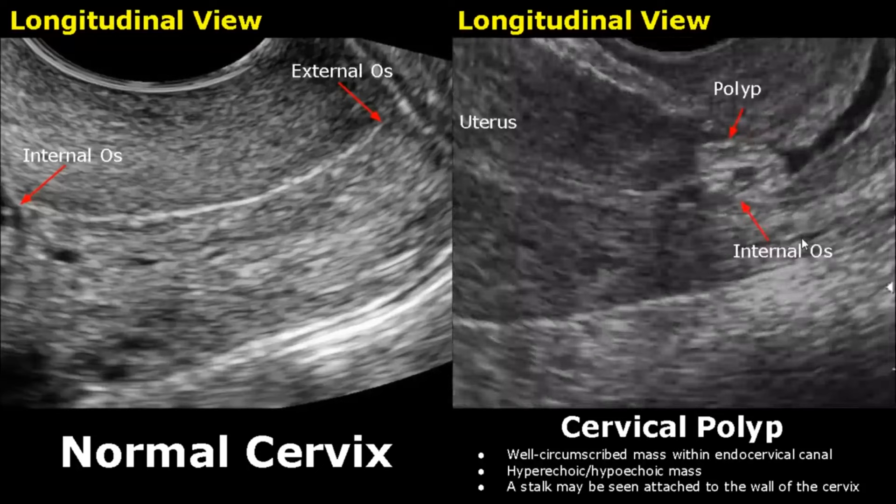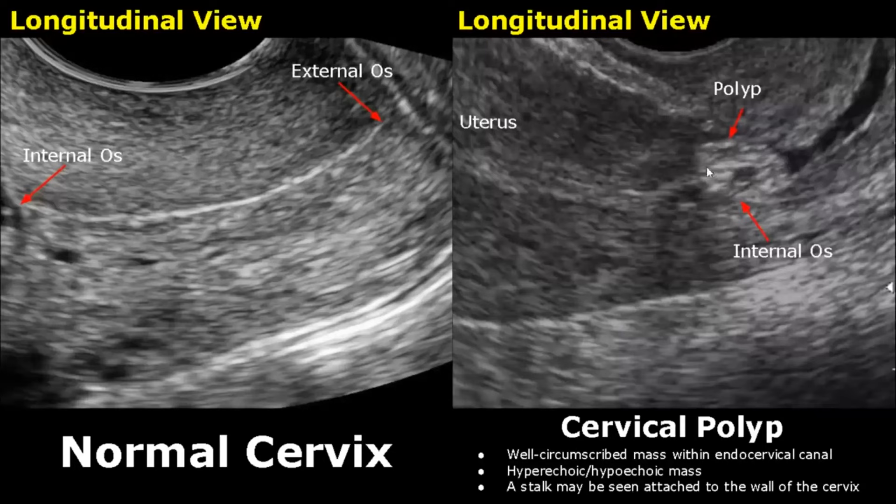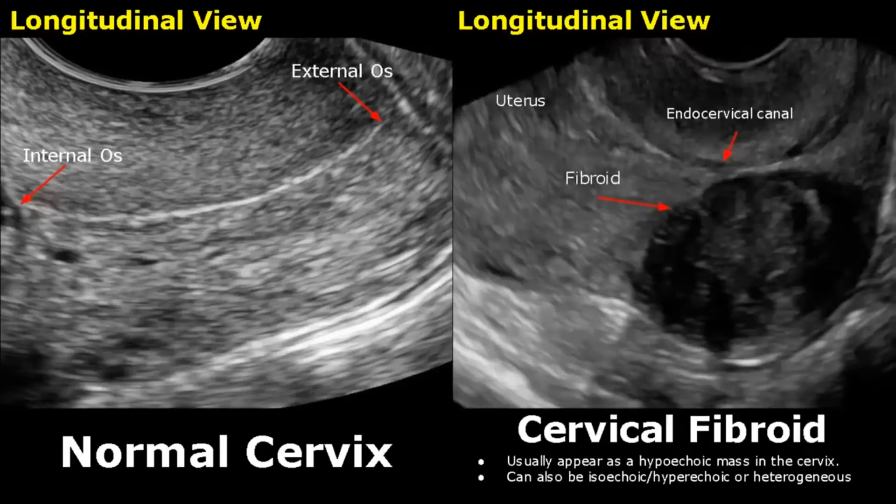This is another case of a cervical polyp — a well-circumscribed round hyperechoic mass in the cervix. A fibroid can also be found in the cervix, appearing mostly hypoechoic but also possibly isoechoic, hyperechoic, or even heterogeneous.